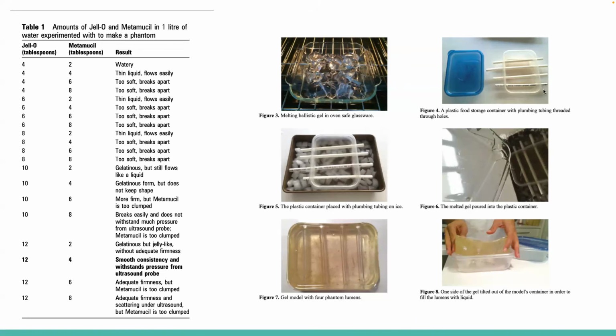Drilling holes into the side of these Tupperware containers. Sometimes what I'll do is get the flexible tubing from the hospital, and I'll pull that and put that across. I've used dowels and filled the really narrow balloons across here for IV models and left that in. Those can sometimes be refilled with ballistics gel or with Metamucil. The ballistics gel will last longer, it's more reusable. But when in doubt, and this is your first time, using Metamucil and gelatin never hurt anybody.